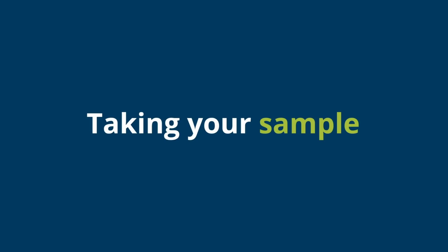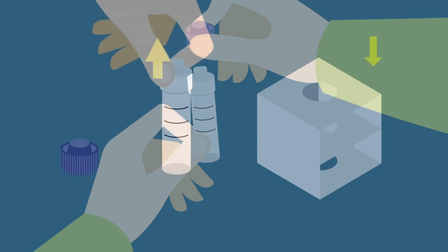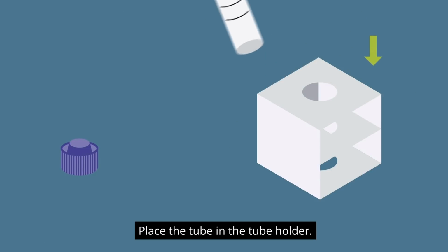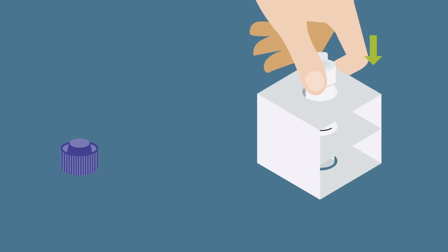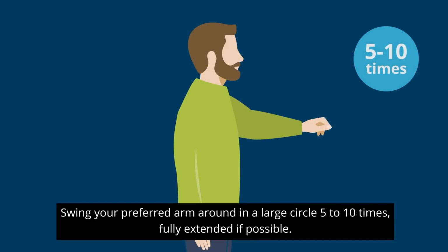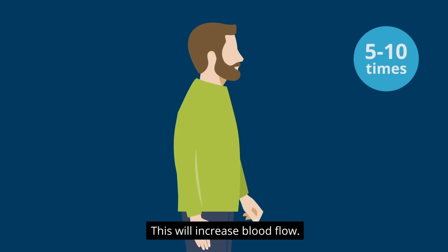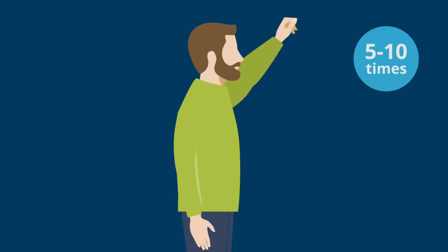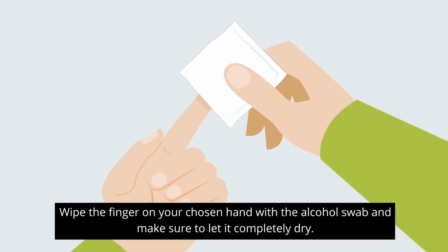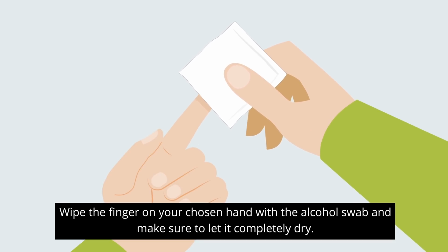Taking your sample. Remove the lid from the small sample tube. Place the tube in the tube holder. Swing your preferred arm around in a large circle 5 to 10 times, fully extended if possible. This will increase blood flow. Wipe the finger on your chosen hand with the alcohol swab and make sure to let it completely dry.